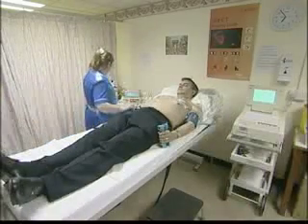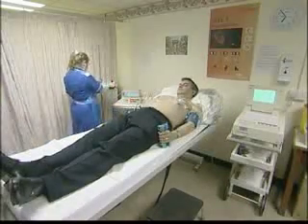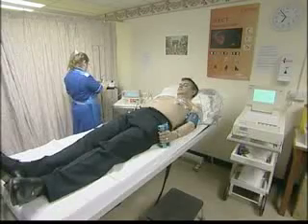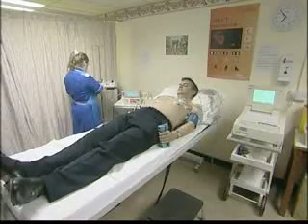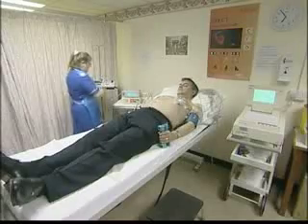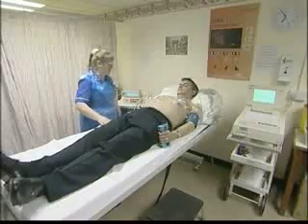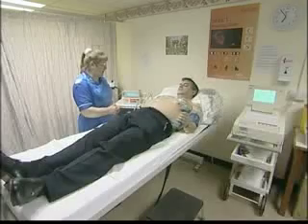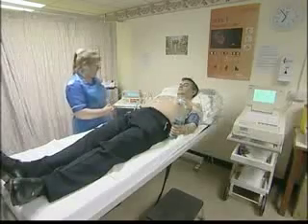This patient is being prepared to undergo a SPECT procedure to look at myocardial perfusion, that is blood supply to the heart muscle. It's usual to scan the patient to look at the perfusion when the heart has been stressed and also when the heart is rested. There can be several days between these two image acquisitions.